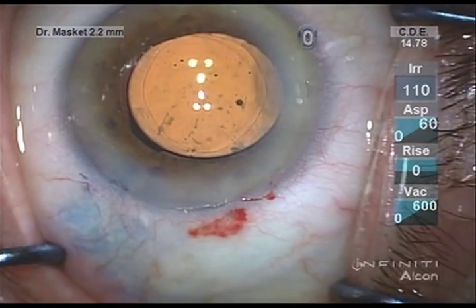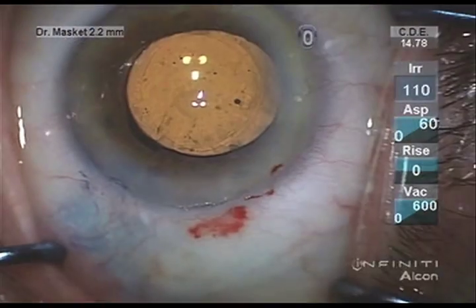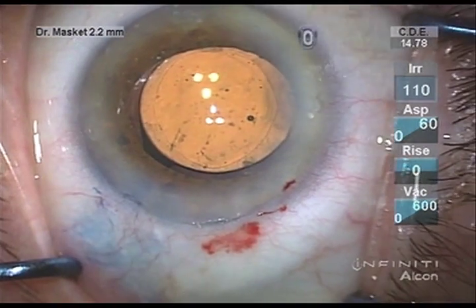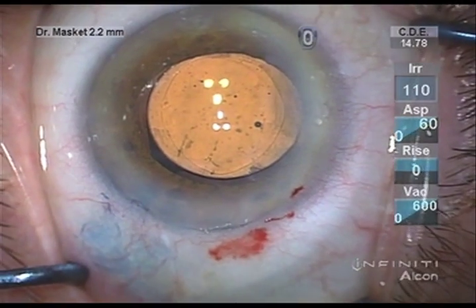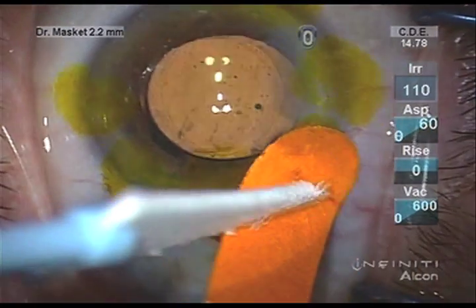Once all the viscoelastic agent has been removed, intraocular pressure is re-established at physiologic levels. Incision competence is tested with the use of point pressure and fluorescent dye. One can note slight jiggling of the lens at this stage of the surgery; however, centration is excellent. The incisions were noted to be watertight and surgery was completed.